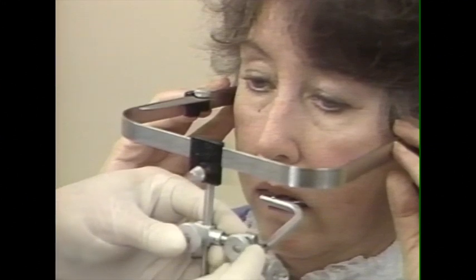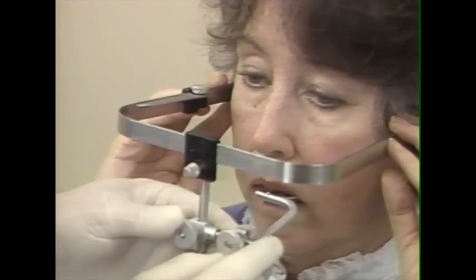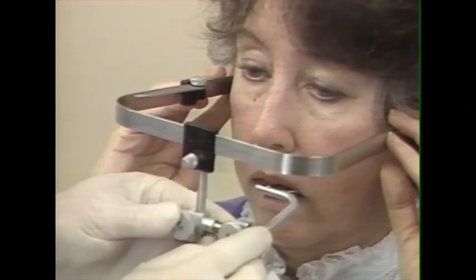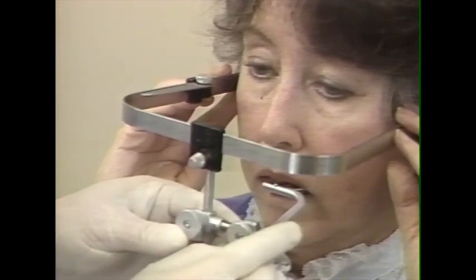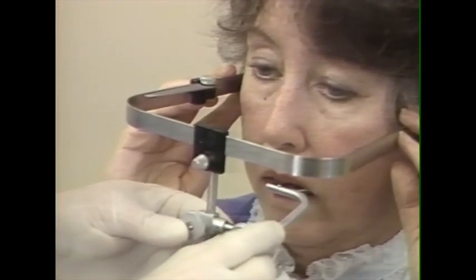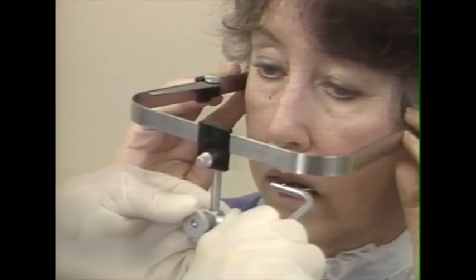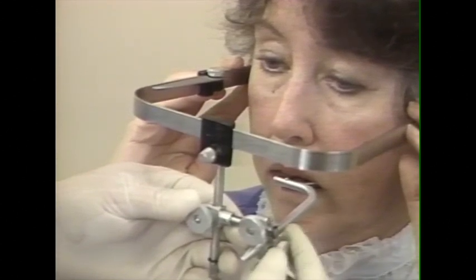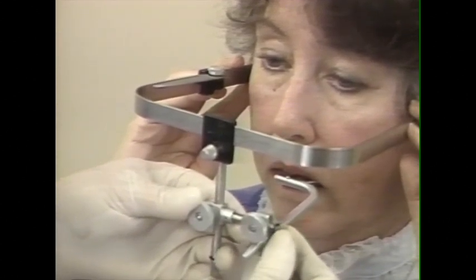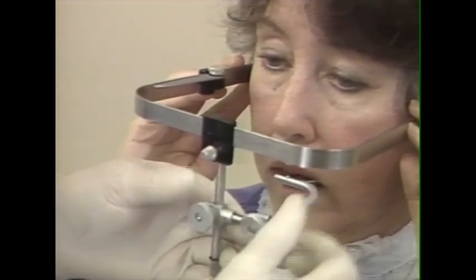We next want to be sure that the Facebow is not in a bind and it's perfectly free. It can be pushed too far to one side so that we will not secure a correct record. We now tighten number 2 and then tighten number 3. Tighten them securely so that it won't slip.